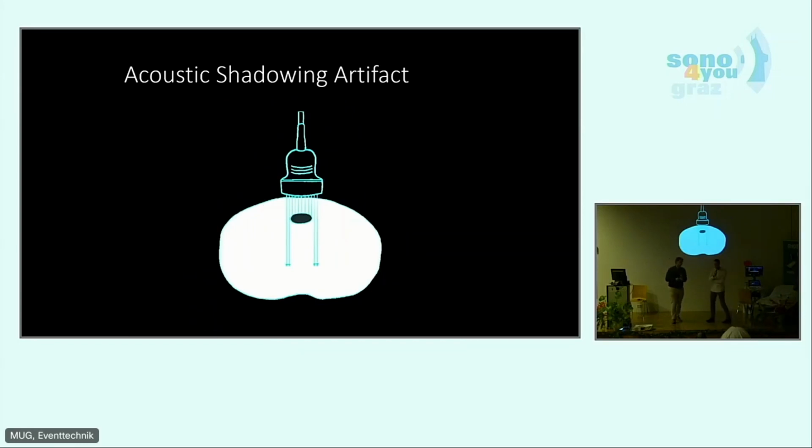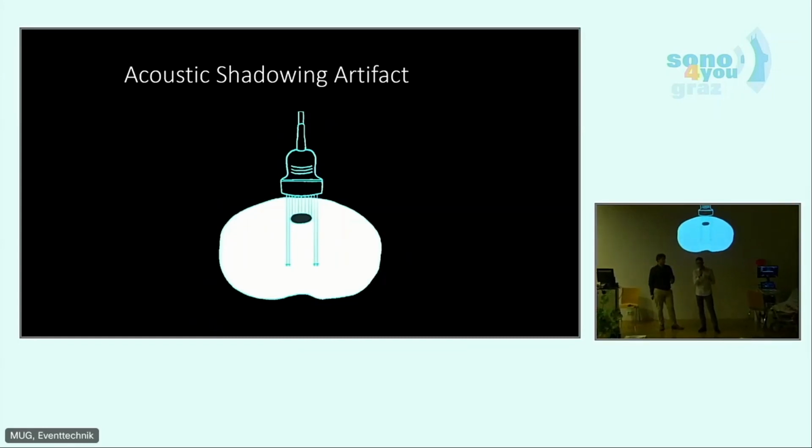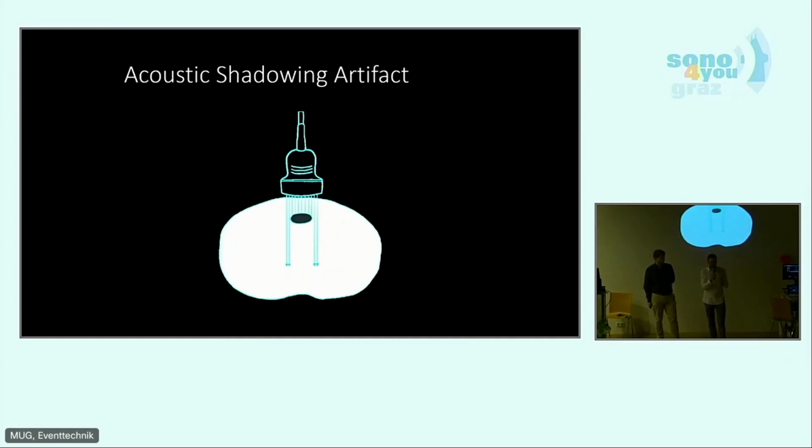So the next artifact is a little bit more simple. It's the acoustic shadowing. We see this black area, which gives a strong echo and does not let the sound beams penetrate. So behind the black area, whatever structure it is, we cannot get any echo. So we have a shadow there.